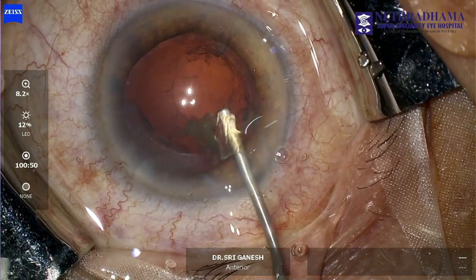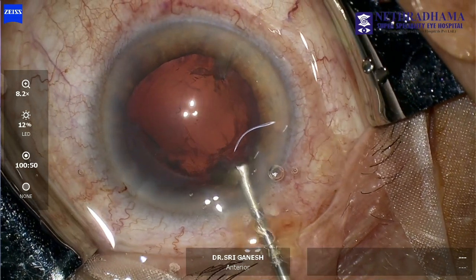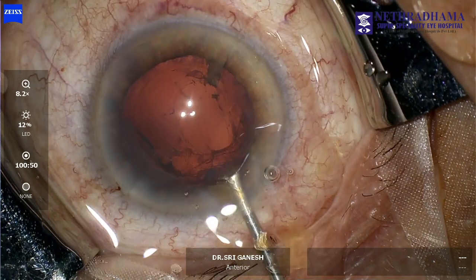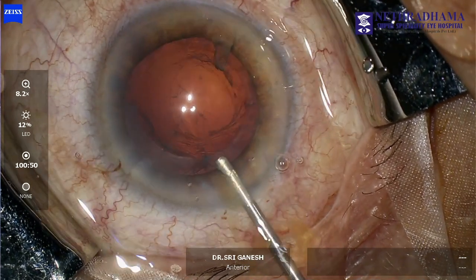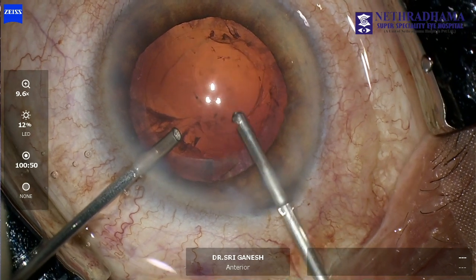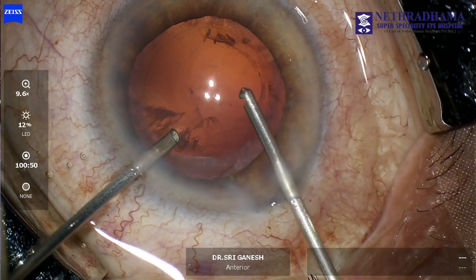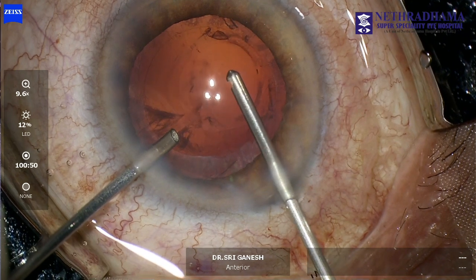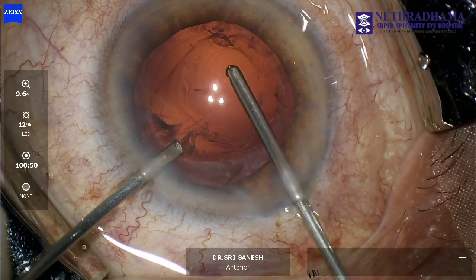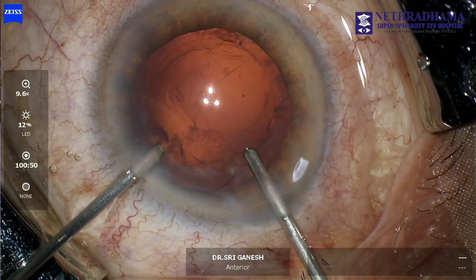There are a few small remnants which are just expressed with visco. But you can see that there is some amount of vitreous which comes out, recognized by the distortion in the margins of the PCR. So we go ahead and do an anterior vitrectomy.